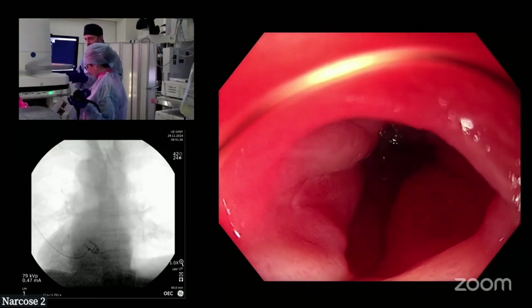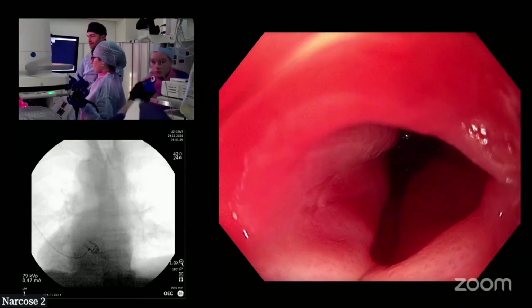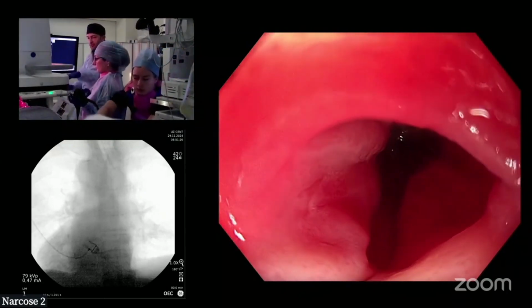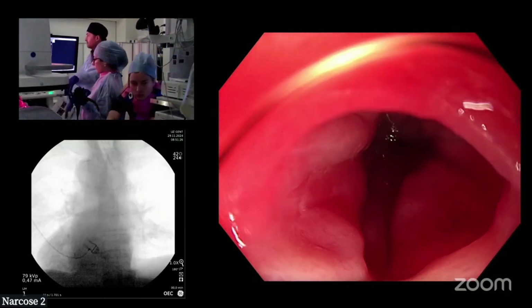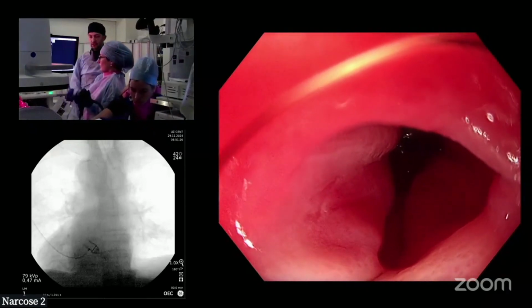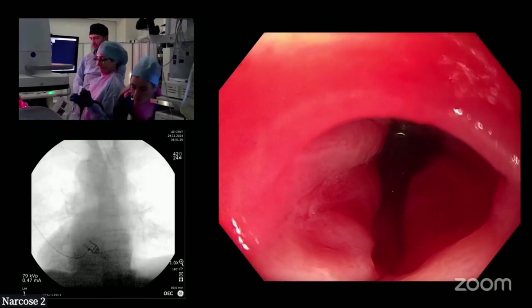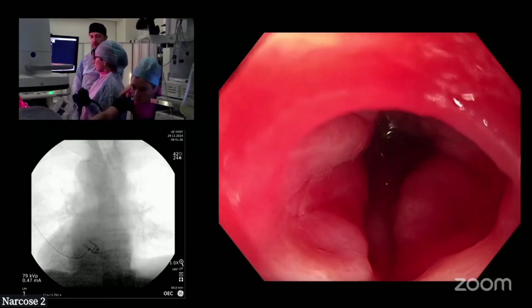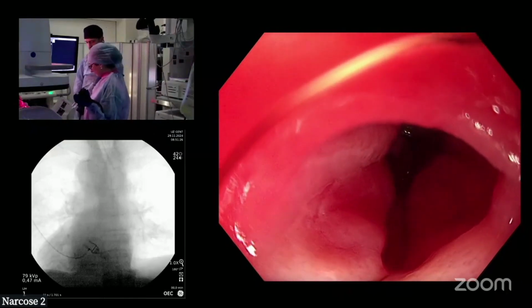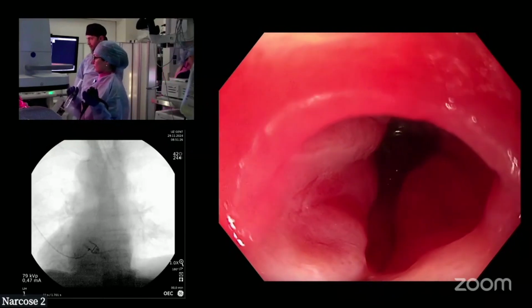We absolutely want to minimize the use of X-ray, okay? So everything possible to minimize it. No positioning before you have the laser light. You can see probably on the screen the laser light. I don't know, you can't, but we have a laser light to localize the X-ray positioning in the center of the patient. Neither we nor the patient needs more X-ray than is necessary, right? Okay. All right. Then we're going to put contrast down then.